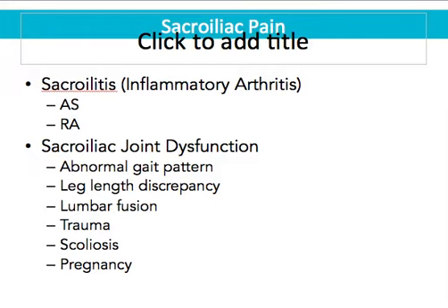All you have to do is trace a line on the top of the iliac crest. And then as that crest comes around, you'll see these bony landmarks, and those are your PSIS, your posterior superior iliac spine. You just mark where that PSIS is, and then you're right there. Right along the medial border of the PSIS is your sacroiliac joint.